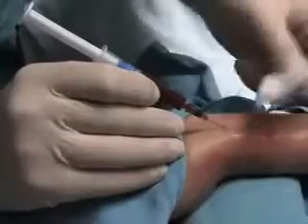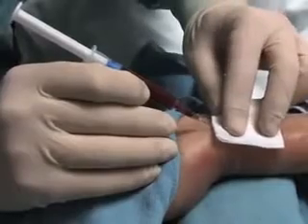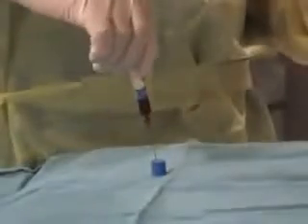After the blood sample is collected, withdraw the syringe and have an assistant apply pressure to the site with sterile gauze for approximately 5 minutes. In the meantime, expel the air bubbles from the syringe. Cover the needle with the attached safety cap and remove the needle from the syringe, or remove the needle from the syringe using the rubber stopper.